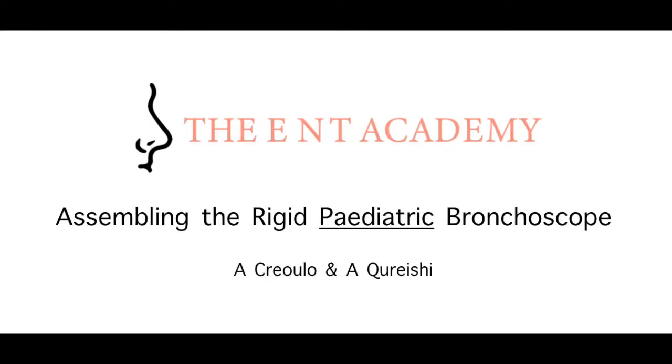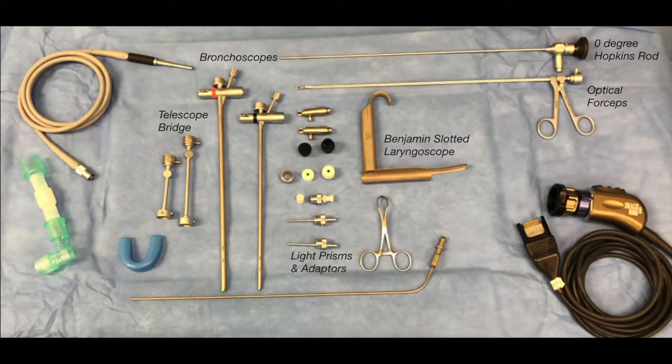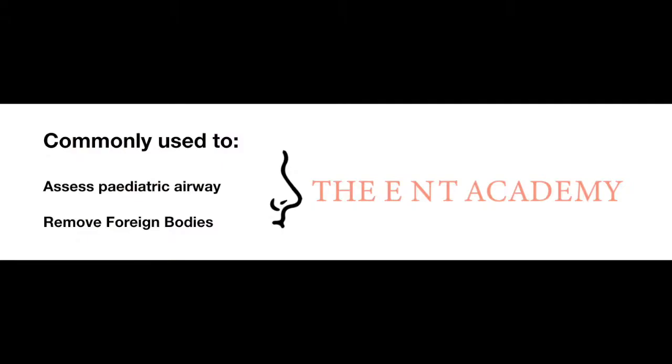Welcome to our instructional video on assembling the rigid paediatric bronchoscope. Our standard set consists of a size 3 and 4 rigid paediatric bronchoscope, a 0 degree Hopkins rod, optical forceps, a Benjamin slotted laryngoscope, light prisms, instrument rubber guides, and suction rubber guides, and equipment for recording and illuminating the procedure. This procedure is commonly used to assess paediatric airways and remove foreign bodies.